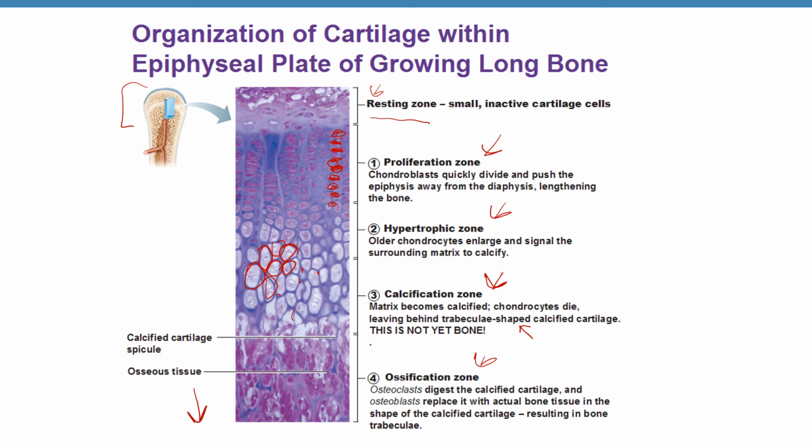Now cartilage is dead here, right? These chondrocytes are dead. Now at the same time, in this zone, we have formation of new blood vessels. So blood vessels entering this area, and blood always brings nutrients, it brings oxygen, but what else blood brings are actually osteoblast and osteoclast. Now osteoclast gonna digest this calcified cartilage. So here's our osteoclast, right?